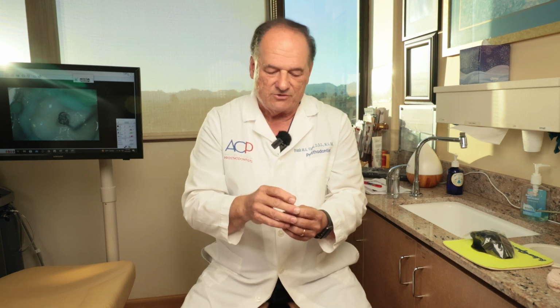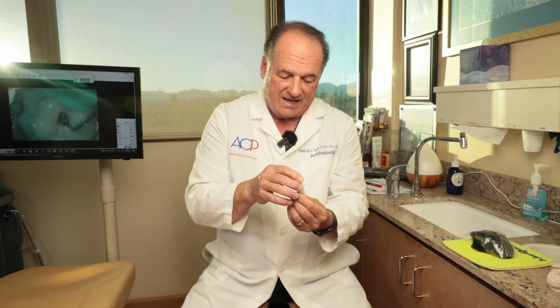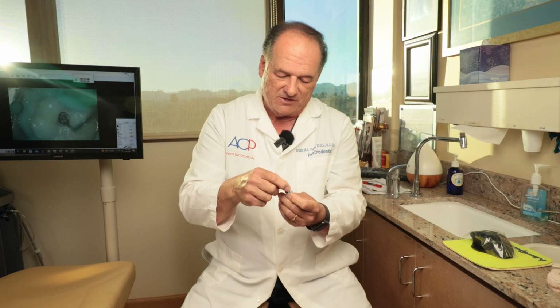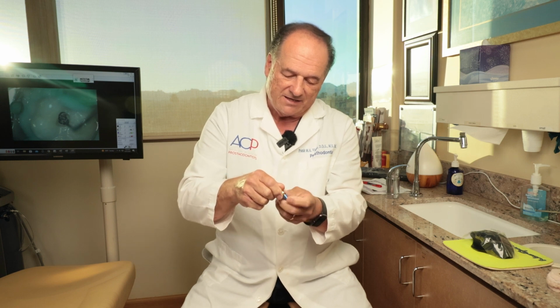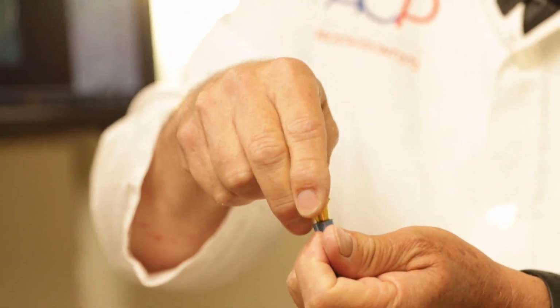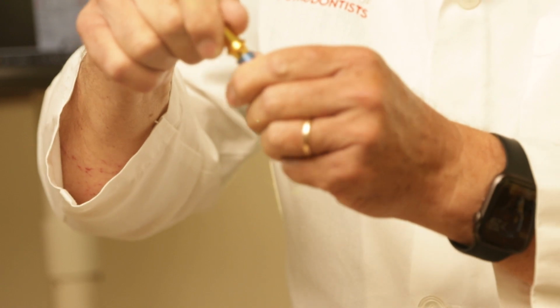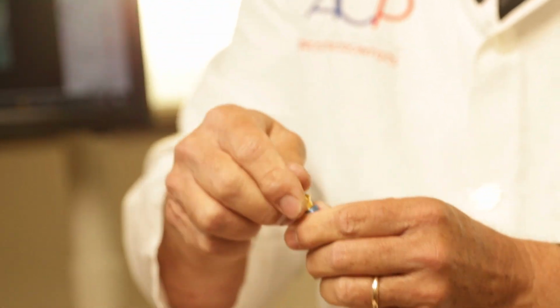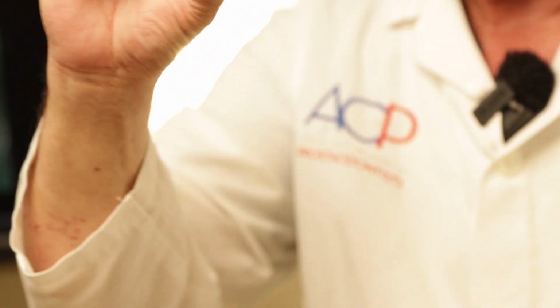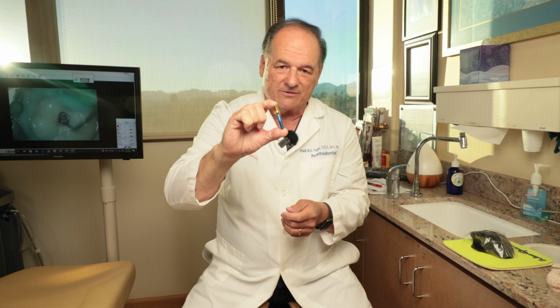Well, we're walking into an area now where we can potentially believe that it's the lifespan of the materials that we're using, potentially the mechanism by which the components are connected to the implant itself. That means the interface. How stable is it over time? Because now you have to understand, this tooth is a mechanical replacement.